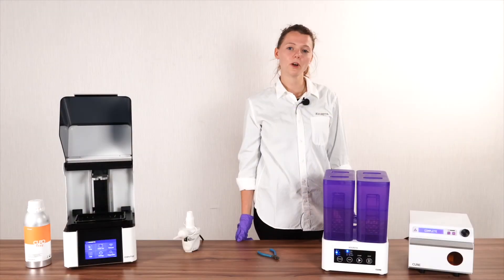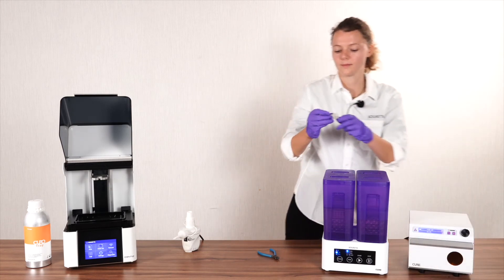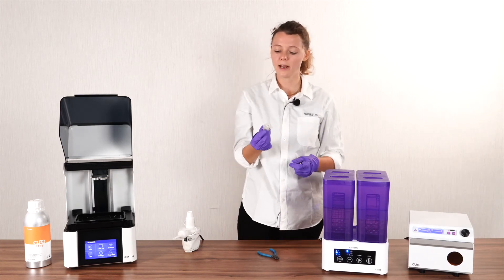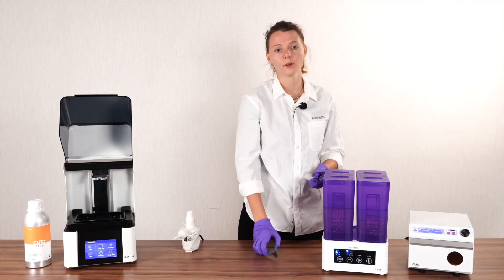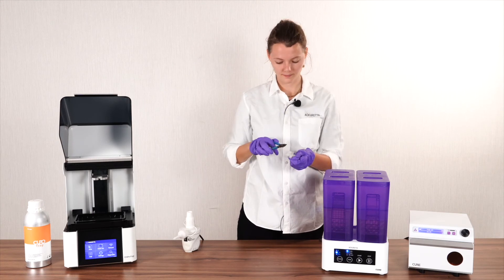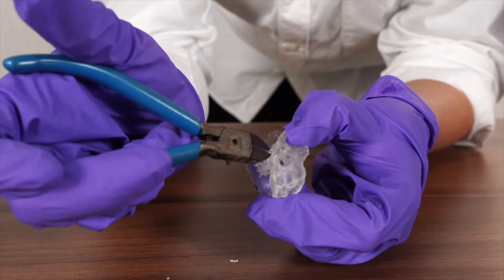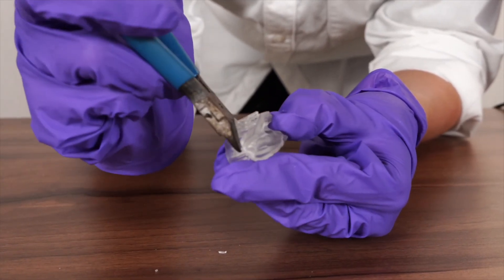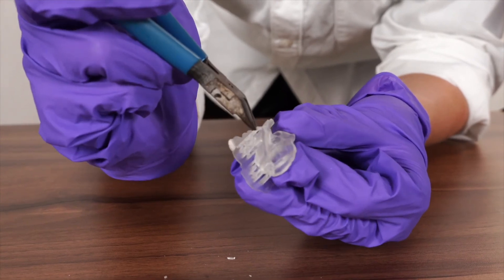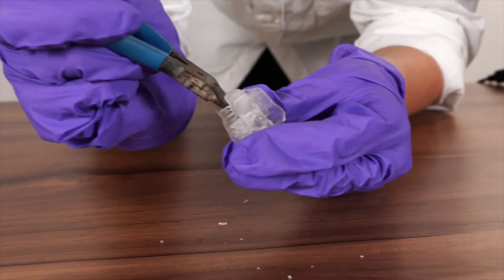Once our UV oven is finished curing, we'll take out our print. The last step now is to remove the supports, either with a knife or with pliers. You want to make sure that you get really close to the point where the supports meet the dental application.